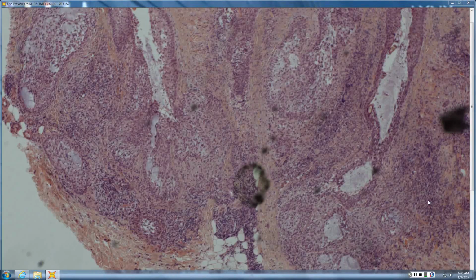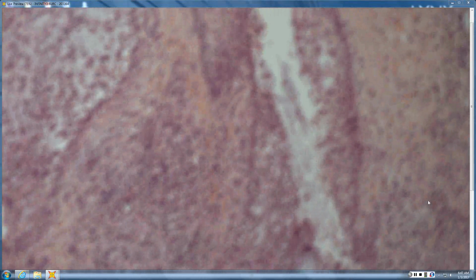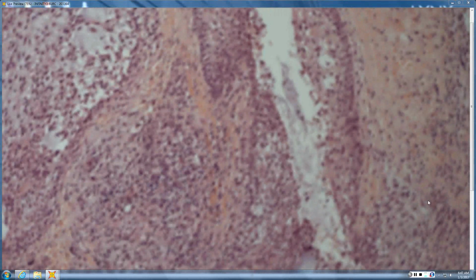So to check for CTCL, you could certainly look for other features. You don't always see them. And in this one, you don't see a whole lot of them, which is probably why it's just listed as alopecia mucinosa. I should also add that you can get the same thing with carcinoma cutis, like metastatic breast to the scalp or something. You can get what appears to be mucin that's follicular based.